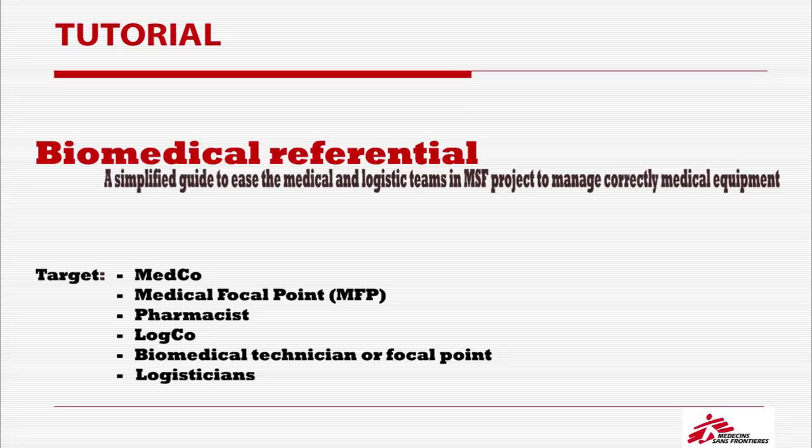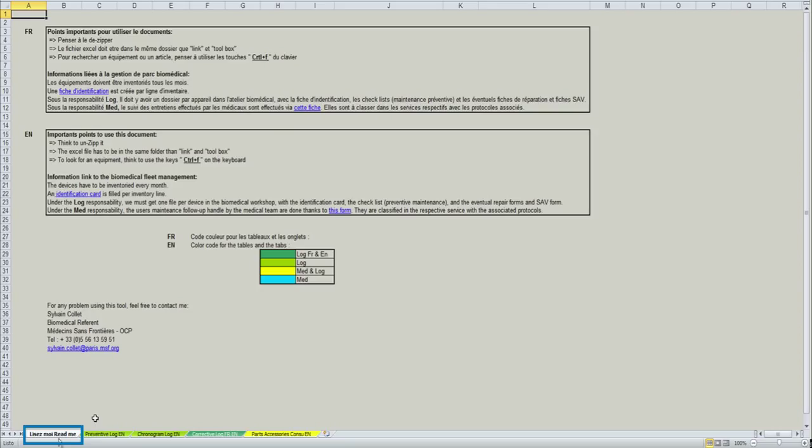This document aims to help any person who is in charge of the management of medical equipment, like med coordinator, medical focal point, pharmacist, log coordinator, biomedical technician or focal point, or logisticians in charge of the preventive maintenance of these devices. First of all, take time to read the first section called Read Me. Then, the referential is divided into 4 worksheets.